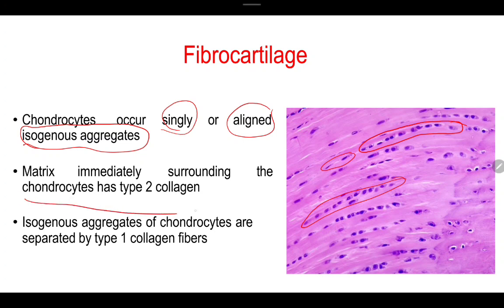It's because yung collagen type 2 sa ating fibrocartilage, dyan mo lang makita kung saan yung mga chondrocytes natin. Okay? So, yung mga matrix that surrounds the different chondrocytes here, like this one, is rich in collagen type 2. So, hindi ko sila makita natural, kasi collagen type 2 man, hindi talaga siya makita.